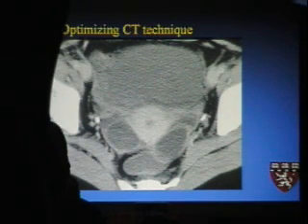It sounds so basic and so obvious, but unfortunately it's rarely done anymore, and pelvic CTs really suffer because of that. And because we're using water and all of the other lack of iodinated contrast materials in the pelvis now, I think we're running into more and more trouble, and that's where MRI, again, is obviously extremely helpful.